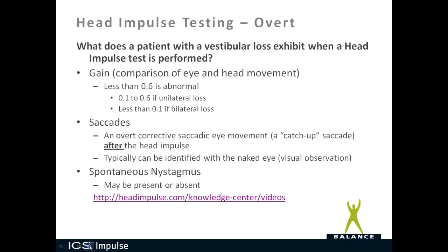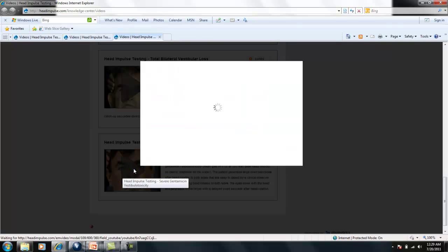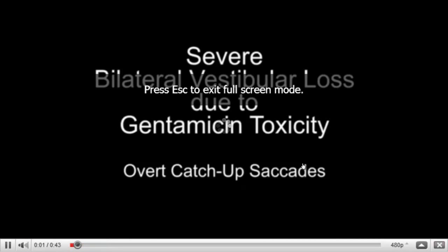Let's go to headimpulse.com and look at a patient with overt catch-up saccades. Again, you can access any of these videos on headimpulse.com. So we're going to look at this patient here who has overt catch-up saccades. Let's make this big.